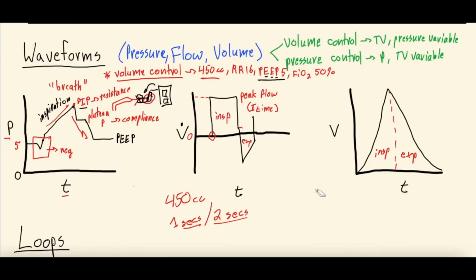So this is the introduction to the waveforms in volume control, with some shout outs to the pressure control changes, different parts of the waveform, what they mean, and a future video, which we'll put in this video's description once it comes out. We'll go into the pathology that can happen and then clinically what you should change.